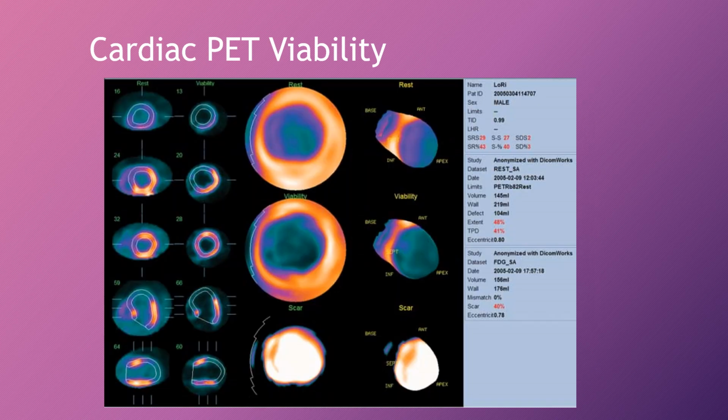This patient did not have a stress portion of the study. They just had a resting MPI study followed by the viability, which is the most common protocol. And this is an example of a matched defect.